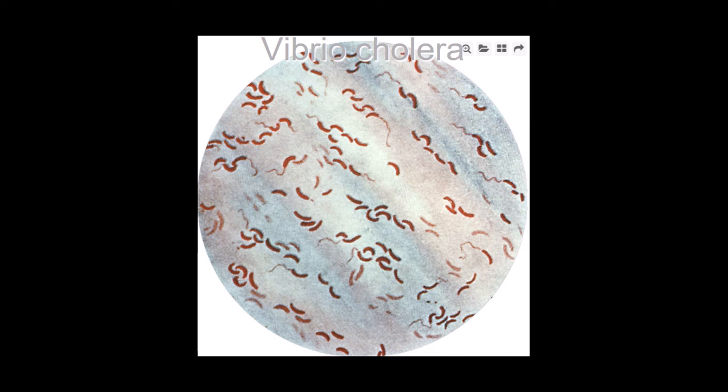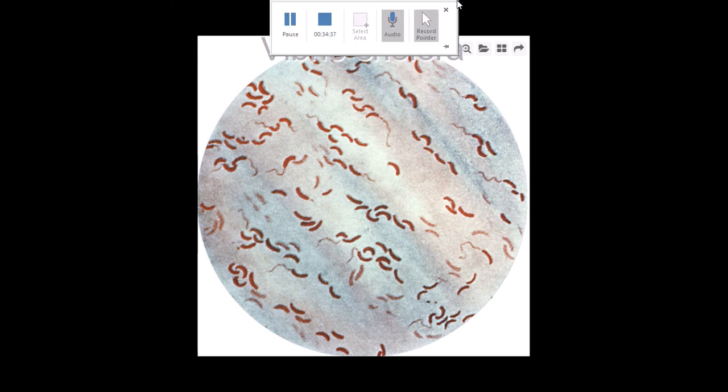Then, it is very important to differentiate those bacteria from the other pathogens, like Vibrio cholerae, for example, mainly by the comma shape or the curved type of rods, and the oxidase reaction. So when you see those, you have to think of those pathogens, as simple as that.